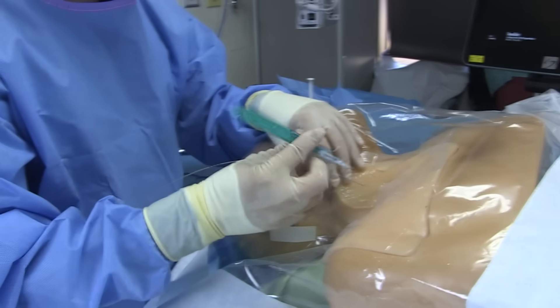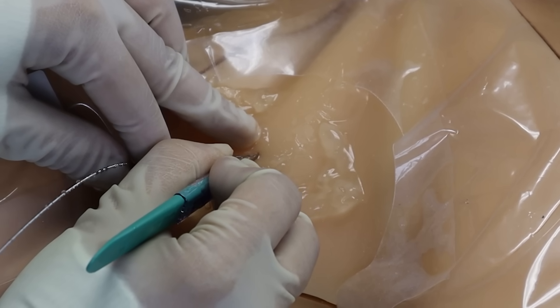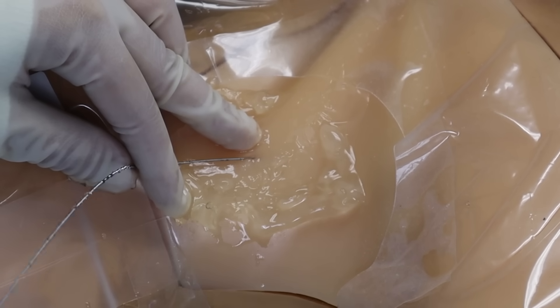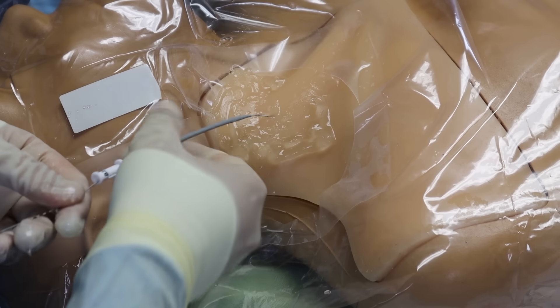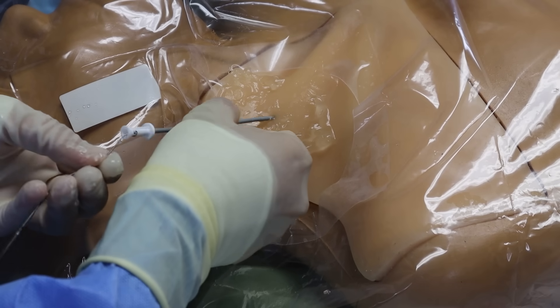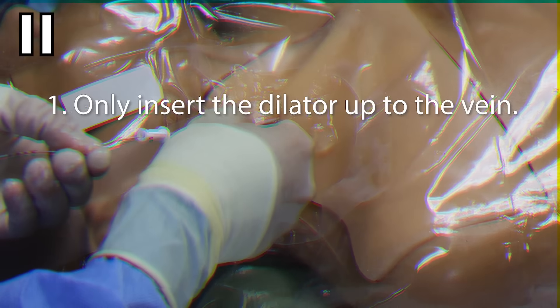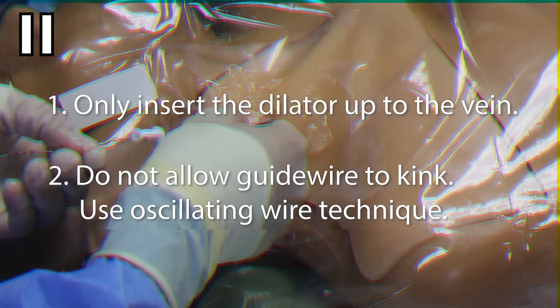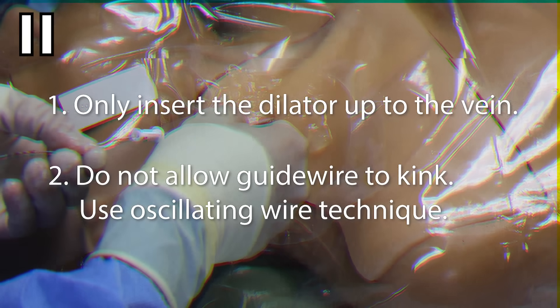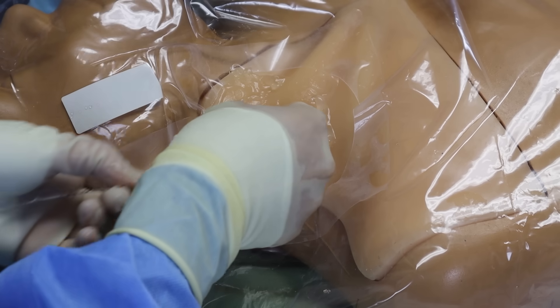Next, grab the 11 blade and slide it down the wire, inserting just the tip right into the puncture site with the sharp edge facing away from the wire. Apply pressure away from the wire as you pull the knife out of the skin to make a small nick at the skin which you can fit the dilator through. Now grab that dilator and feed it over the wire to get it to the skin. Applying firm but steady pressure and with a bit of a twisting motion, dilate the skin and the subcutaneous track. You only need to insert the dilator up to the anticipated depth of the jugular vein, which is usually no more than 3-4 cm. To prevent kinking of the guide wire, gently oscillate the wire back and forth to ensure it continues to glide smoothly as you advance the dilator.